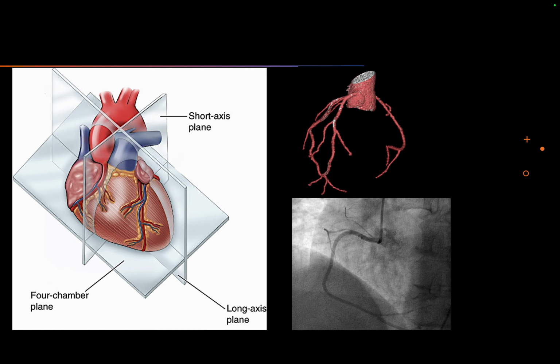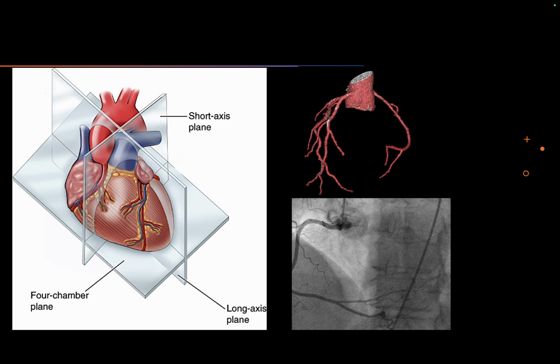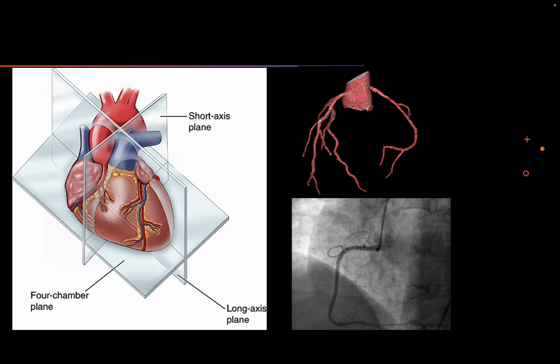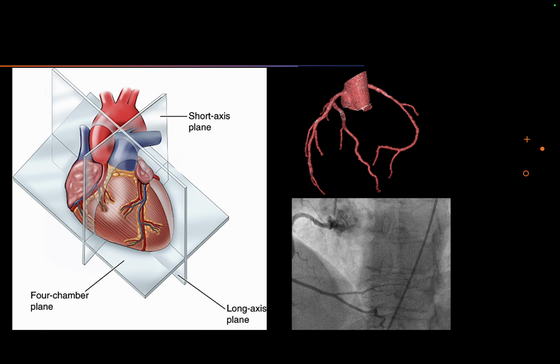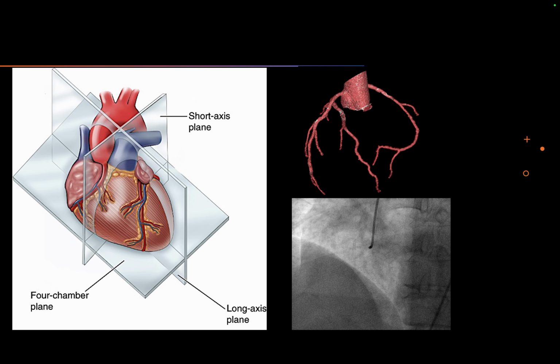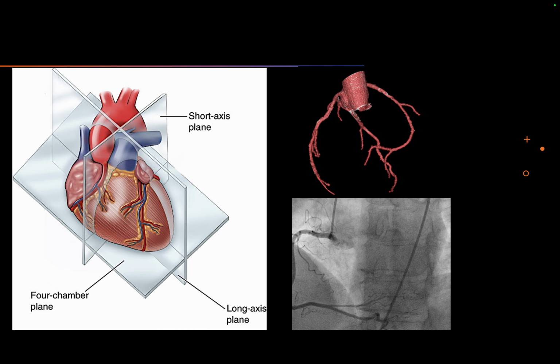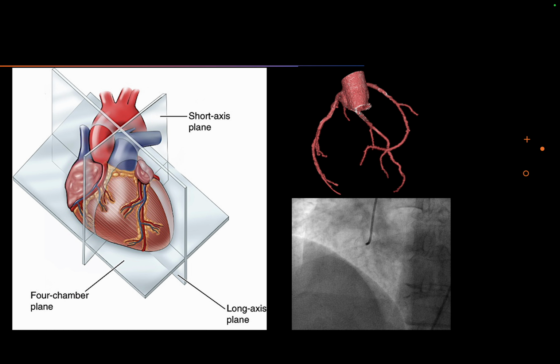But in echocardiography you have to move the probe and take the images piecemeal. It doesn't come as a holistic view of all coronary arteries together. So we have to step up echocardiography to see each segment of the coronary artery separately and analyze it.